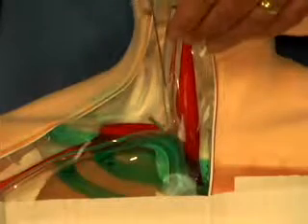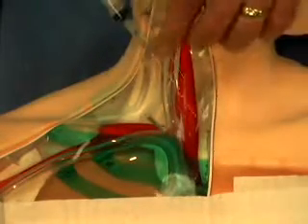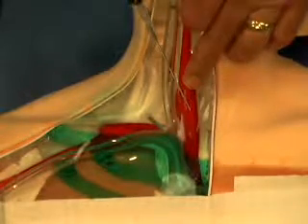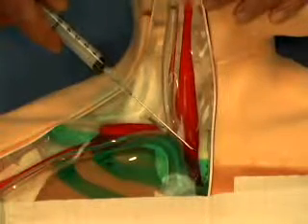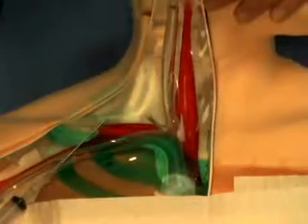When using the guide wire needle, it's important to be aware of the depth and the angle such that you can avoid a major vascular injury, such as shown here, where one can injure the innominate vein, or here, where one injures the common carotid artery. This is true for each of the different approaches, whether it is supraclavicular or infraclavicular, for example, injury to the subclavian artery.